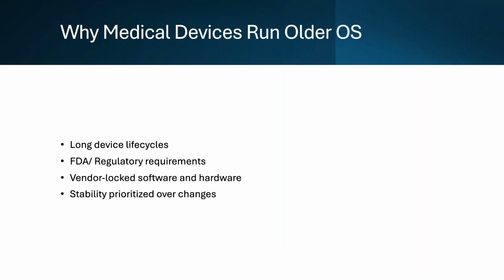Third, many devices use vendor-locked software and hardware. The device manufacturer may have customized the operating system or built dependencies that make upgrading impossible without replacing the entire system. Finally, stability is often prioritized over updates. In healthcare, we need devices that work consistently and predictably.